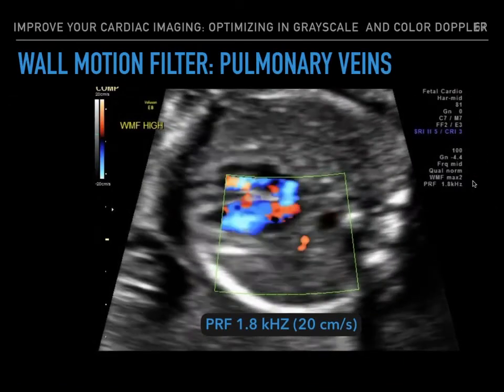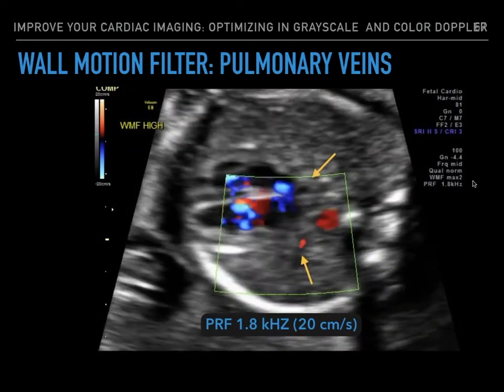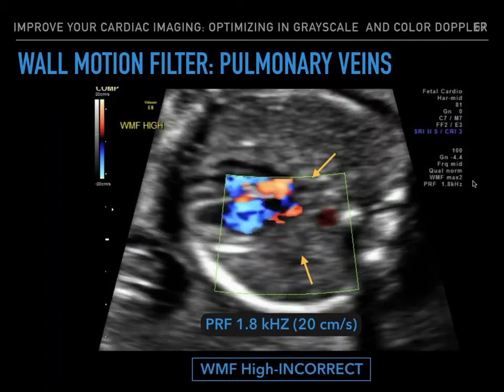Same with the pulmonary veins. Here we have our PRF scale set to low at 1.8 kilohertz. Yet we are not seeing the pulmonary veins filling in. This is due to an incorrect wall motion filter set to high.